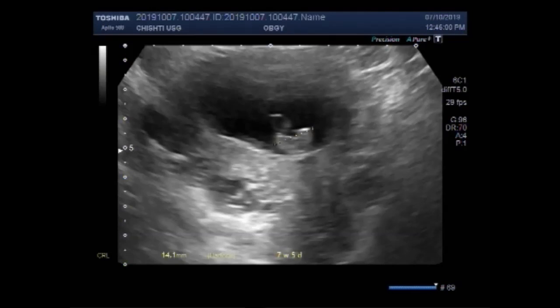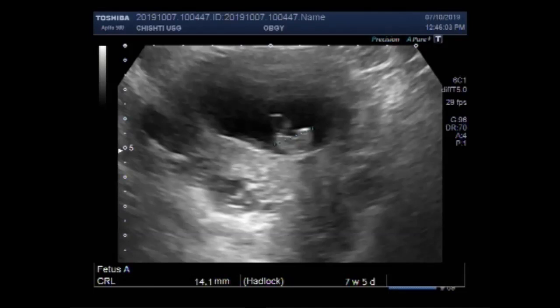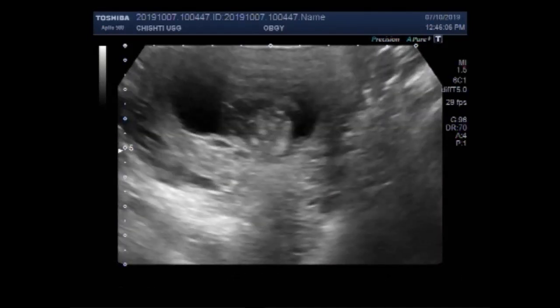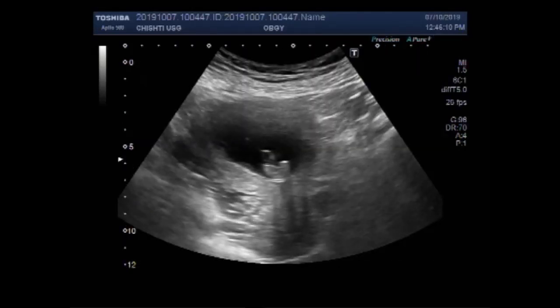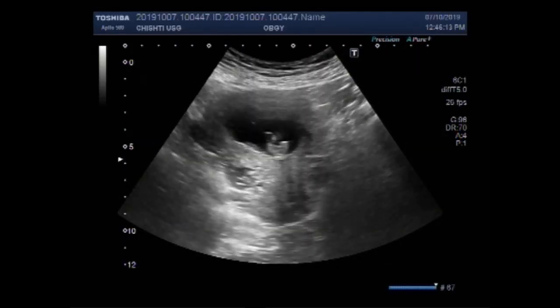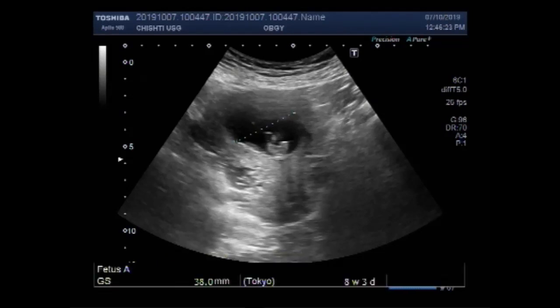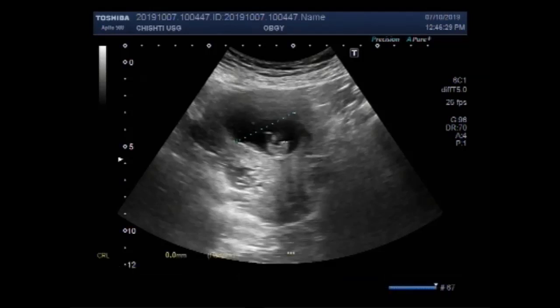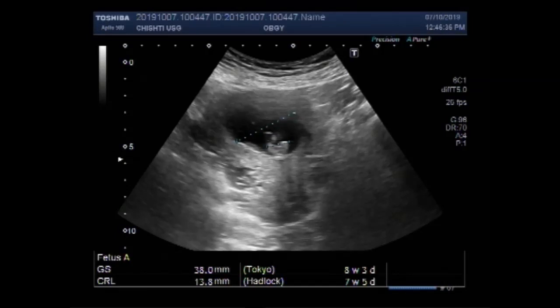Now you can see the crown-rump length, and the fetal age measures about seven weeks, five days. Now the gestational sac is measured at 38.0 mm, corresponding to a pregnancy of about eight weeks, three days. The mean average comes to eight weeks, one day.